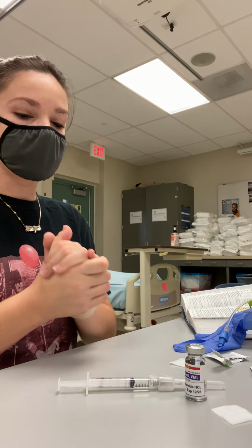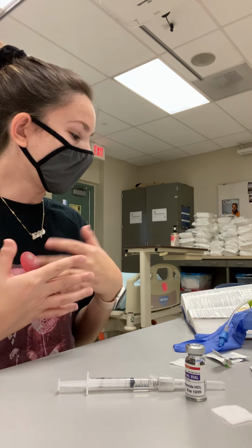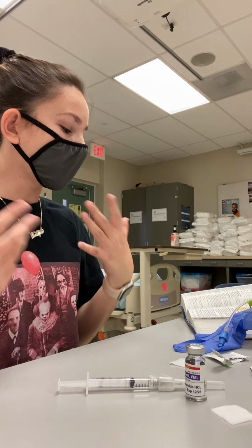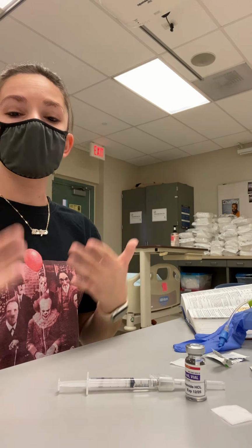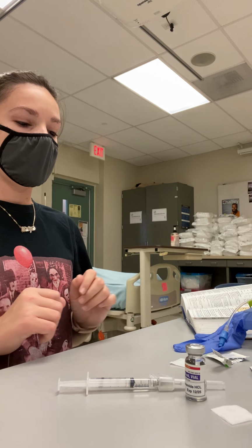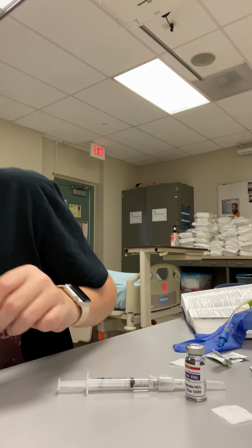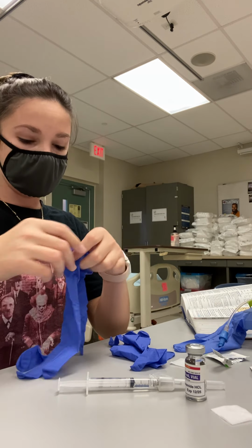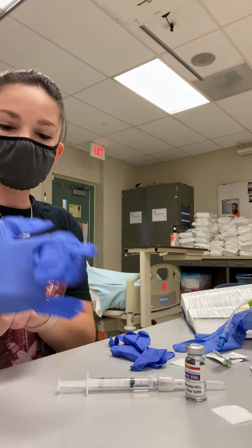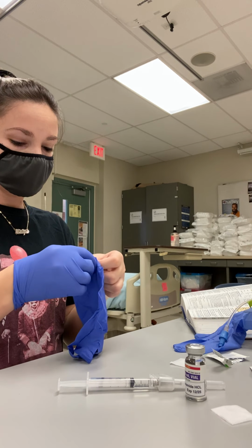And now you will explain to the patient the medication that they're getting. So metoclopramide is an antiemetic, so it affects the tissues of the upper GI tract. So you will explain to the patient what they're getting it for, and you will put on your gloves. So you will get clean gloves. And pause the IV and make sure it's clamped. And how are you feeling, Mr. Smith? You good? Okay.